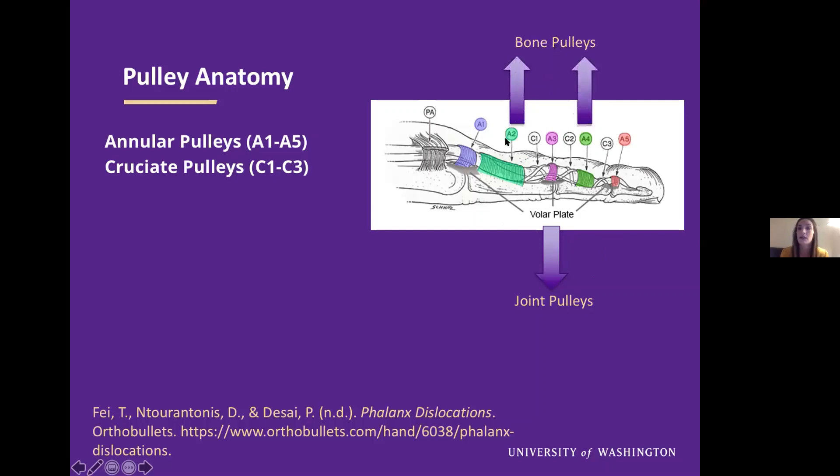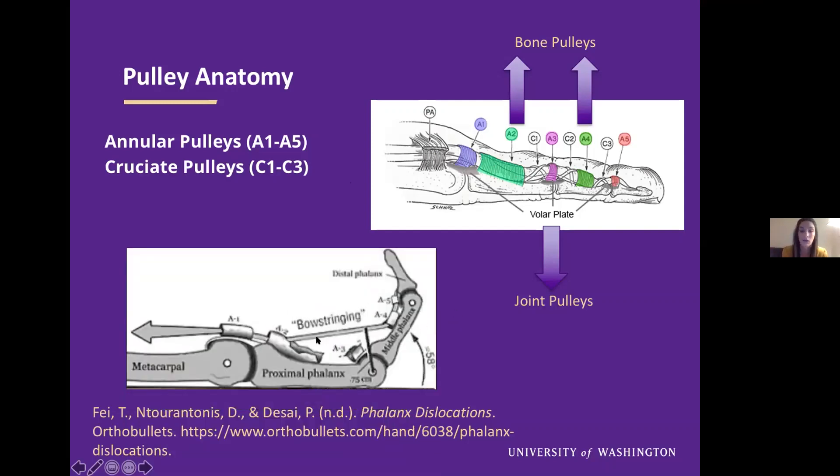We then have our bone pulleys, A2 and A4 — A2 arising from our proximal phalanx and A4 from our middle phalanx. These are going to be our most injured pulleys, with A2 being number one and A4 shortly after. These two pulleys are the most important for pinch and grasp. Without these structures over your flexor tendons, you can get bow stringing or anterior bow stringing, where the tendons have moved away from the bone, putting them at a mechanical disadvantage and impairing function. There are also cruciate pulleys one through three, which are harder to evaluate via ultrasound.